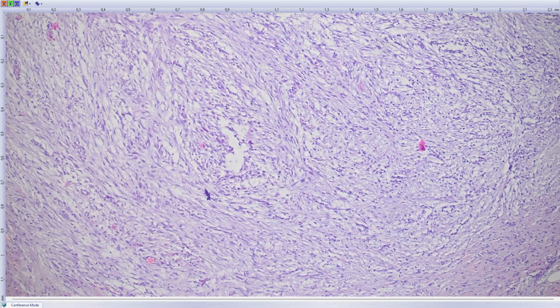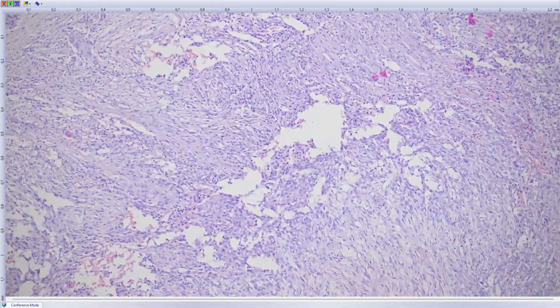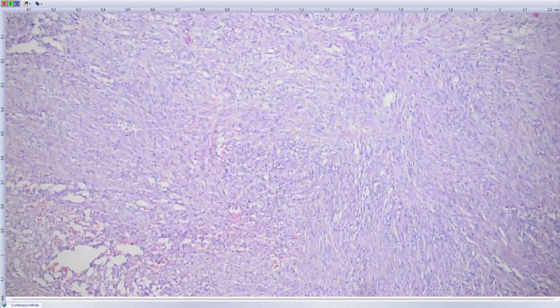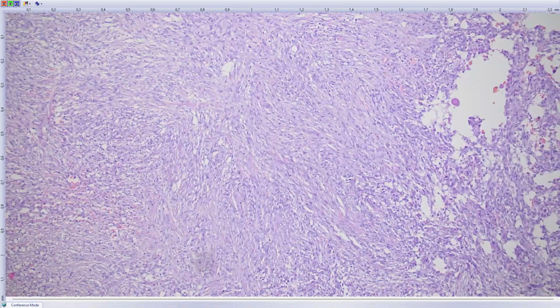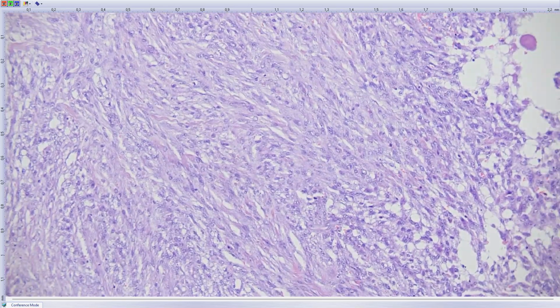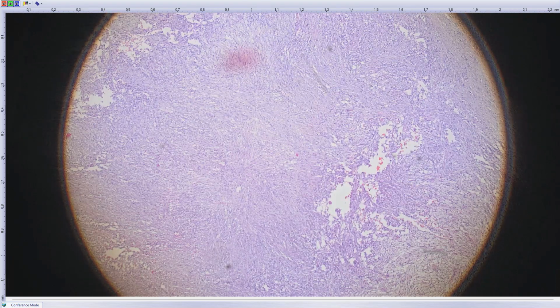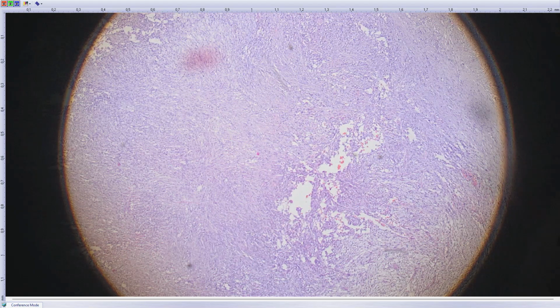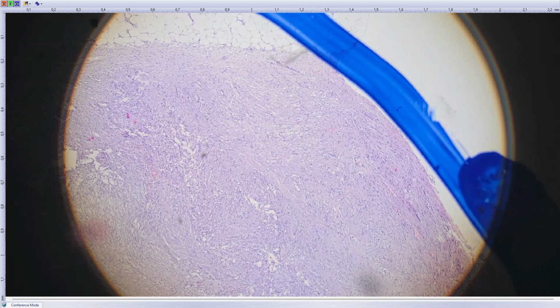But in any case, the morphology, I think many people in this room know straightforward what this is. So it's very cellular, very alarming looking for people that are unaware of these tumors. There are a lot of mitoses, a lot of mitotic activity. And the clinical scenario is also often very alarming, a rapidly growing lesion. Often it grows into several centimeters in size within 2 or 3 weeks. But still, this is a completely benign lesion called nodular fasciitis.